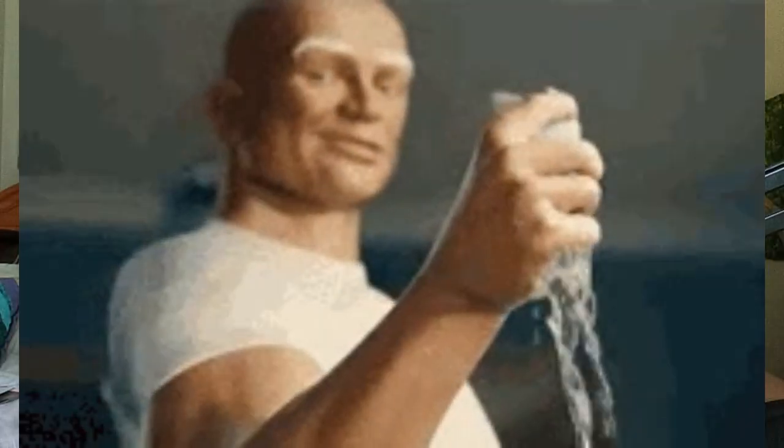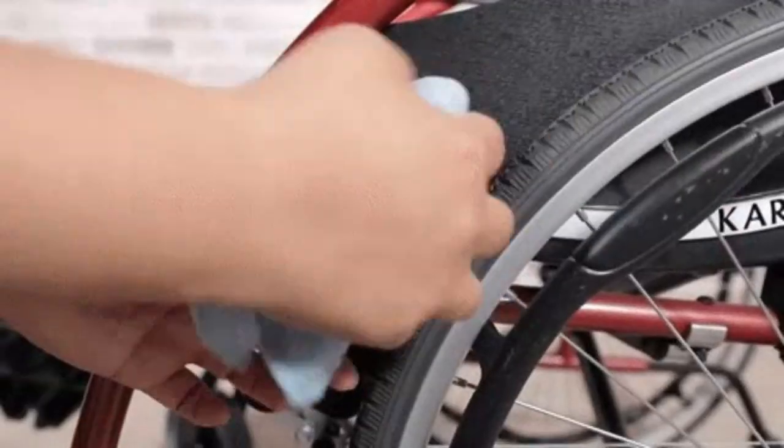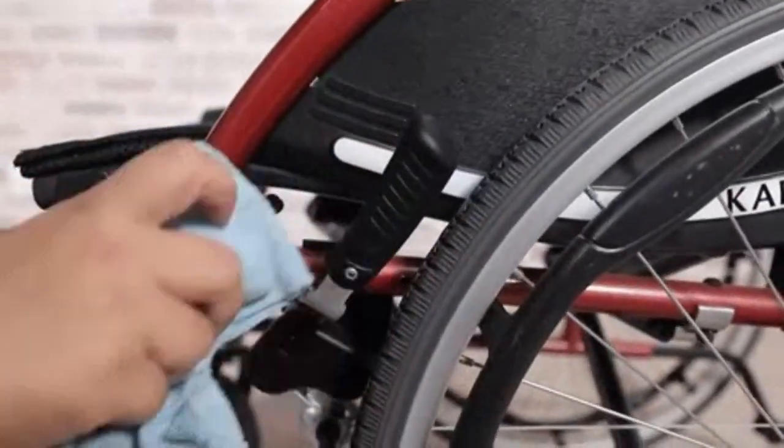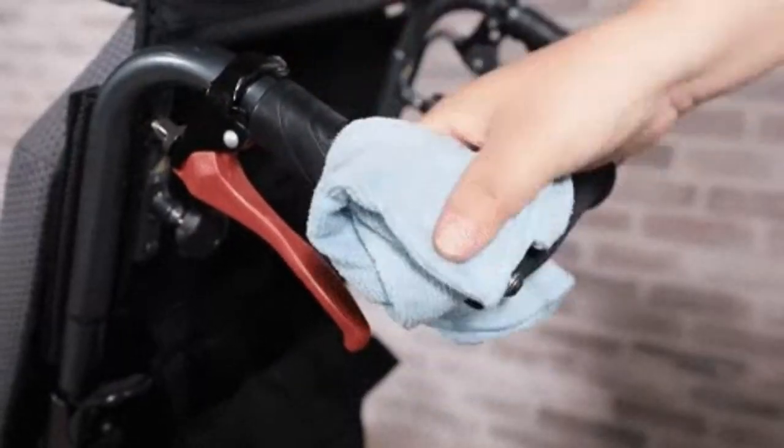Now we're going to go to the action. Take the rag and put it in the water, then wring it out really, really well so it's not drippy at all. You don't want any drippy rags around a power wheelchair. Make sure it's unplugged. Then wipe the chair down — wipe the armrest down, the casing down below, on top of the wheels or the wheel wells — and you're good to go. Let it dry off.